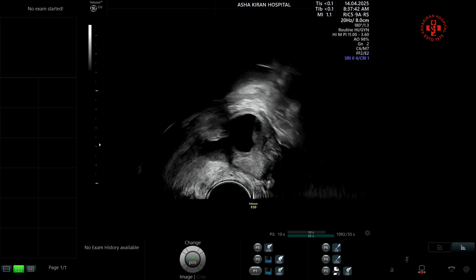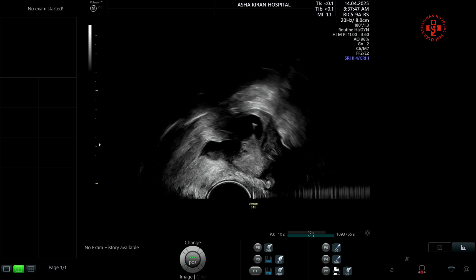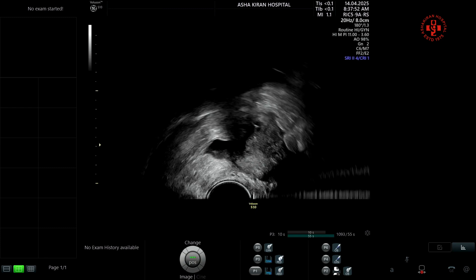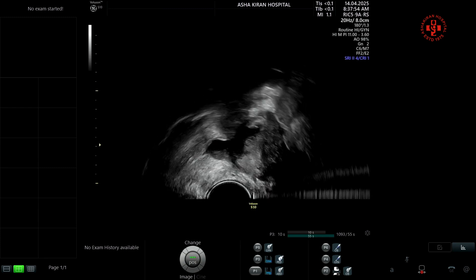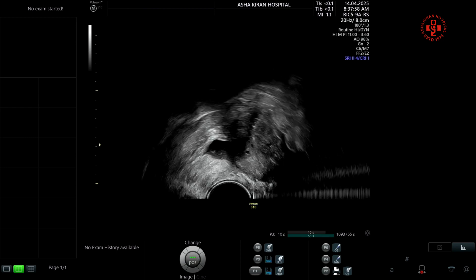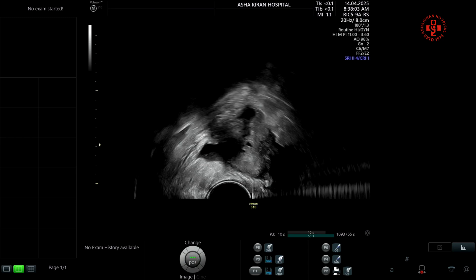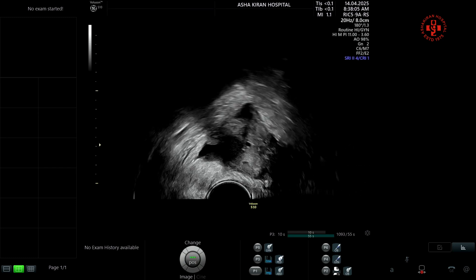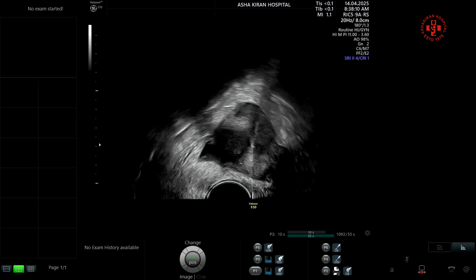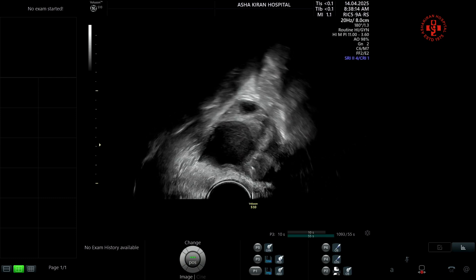We decided to proceed with the brush technique, which has already been published. Here you can see we are aspirating follicles at the periphery of the endometrioma, including one follicle just above the endometrioma. Because this patient has an AMH of 1.3, we feel that even a single follicle should not be left behind out of fear of endometrioma aspiration or future complications like abscess formation.